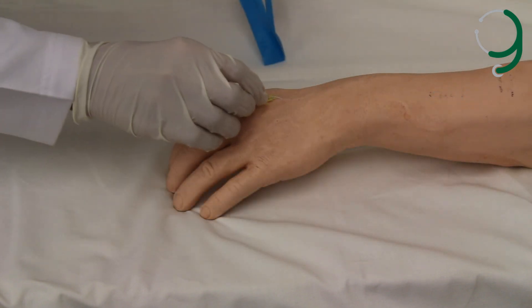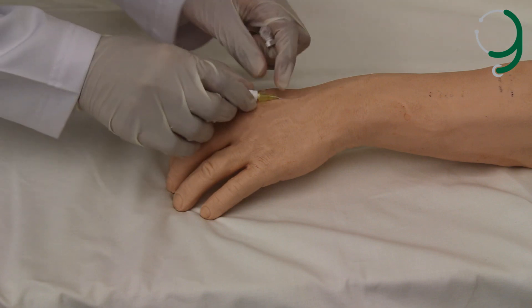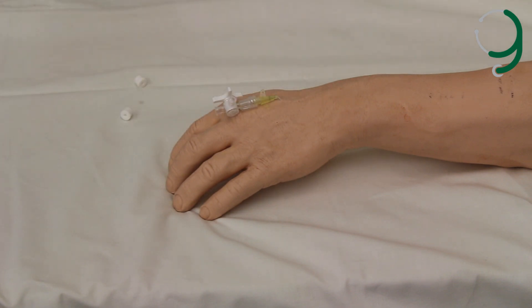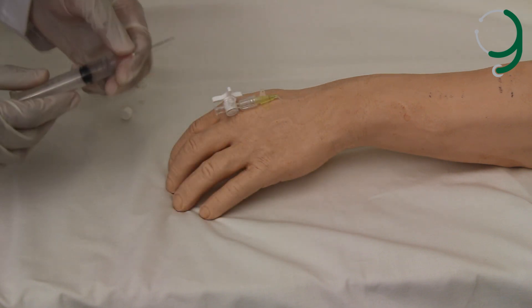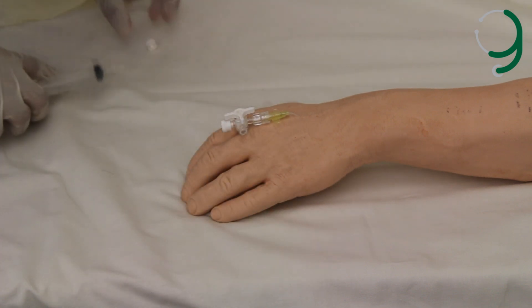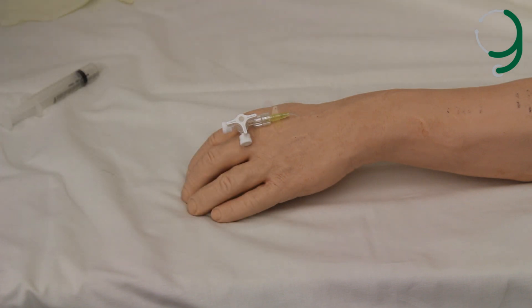You also remove the tourniquet. You can check the patency of the cannula by injecting IV saline into it. Ensure that there's no bubble in the needle. You dispose the needle and then inject the normal saline. Once you finish, you close the cannula. Look for any signs of swelling, resistance, or if the patient experienced any pain.